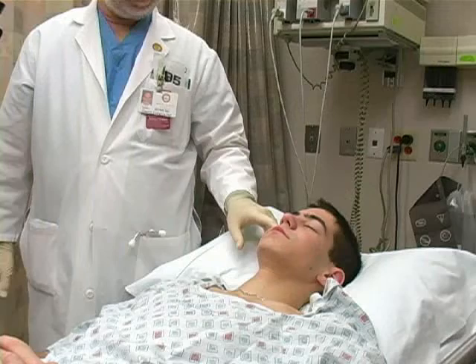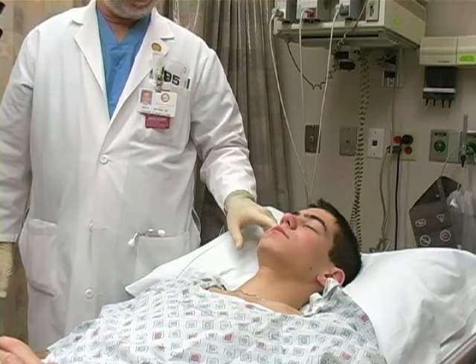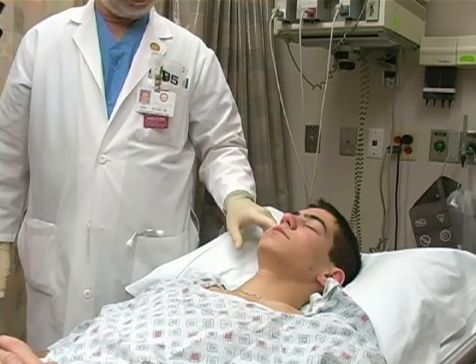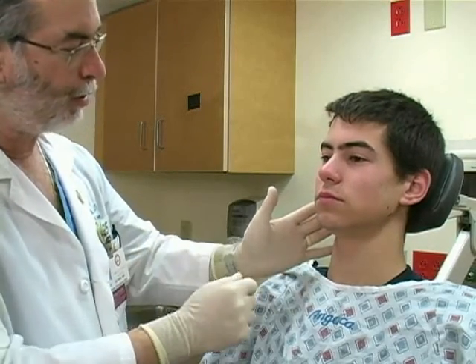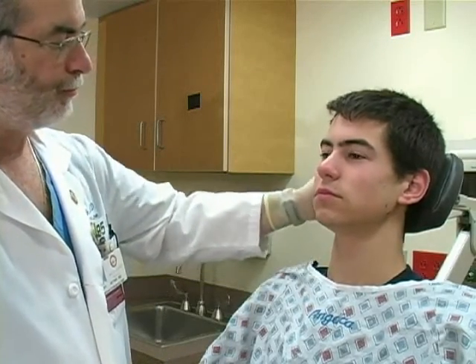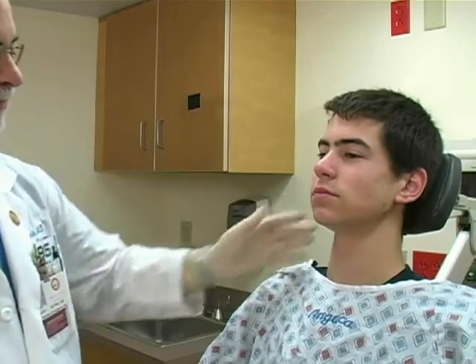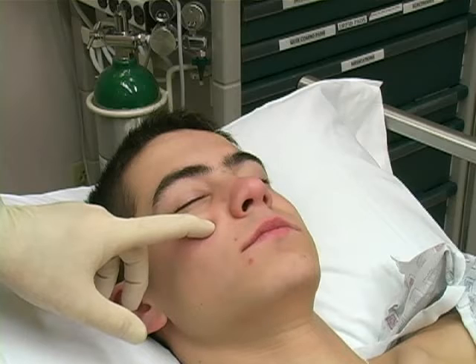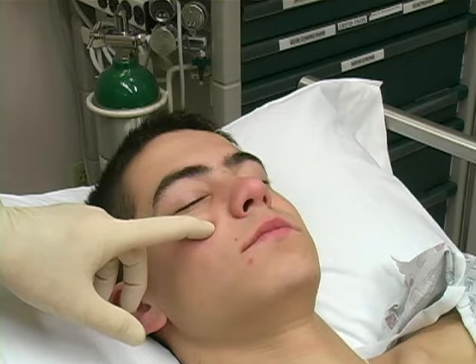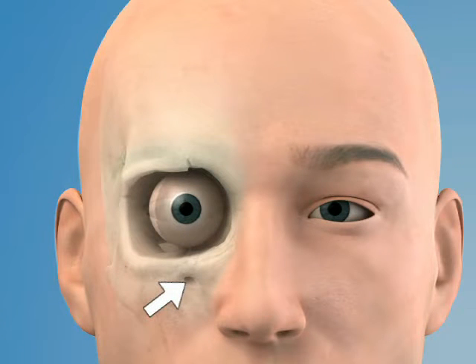To perform the block, position the patient either supine in a stretcher or sitting in a dental chair with the occiput firmly supported and the body of the mandible parallel to the floor. Identify the infraorbital foramen by palpating along the inferior border of the infraorbital ridge. The foramen is in line with the pupil when the patient is staring straight ahead.